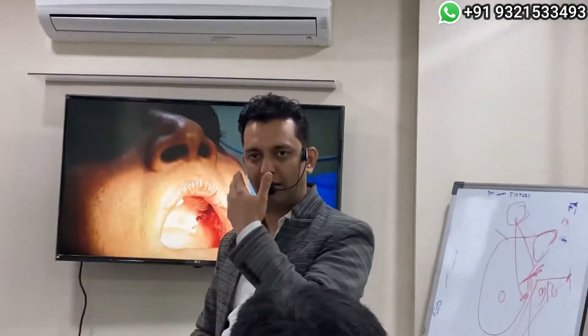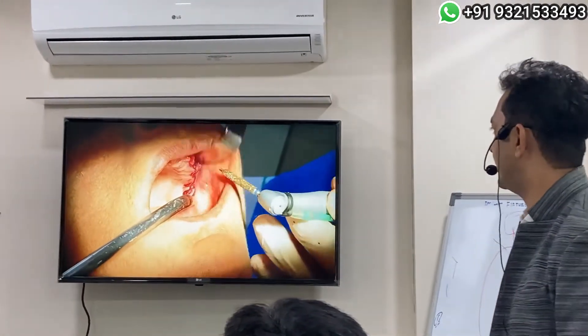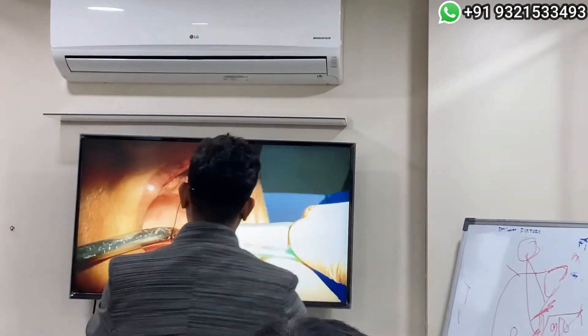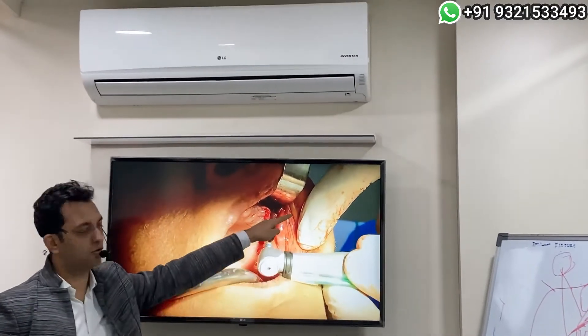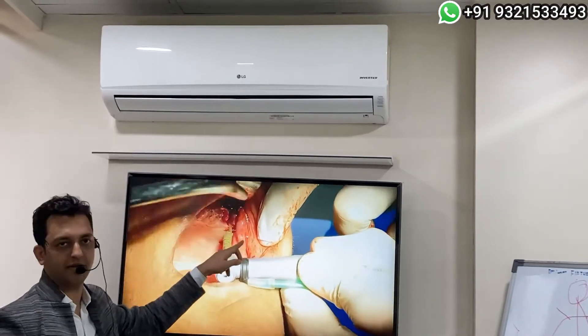I need to go a bit more laterally, so I deepen the slot again with my diamond drill. If I go too much vertically, only if I deepen the slot can I go more laterally — so I'm deepening the slot over here in this area.